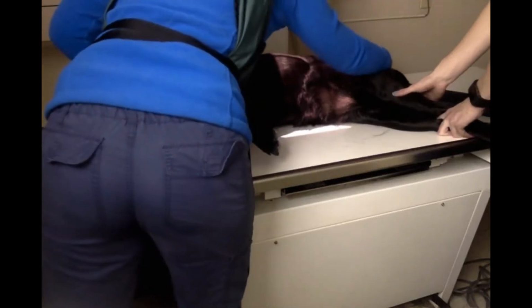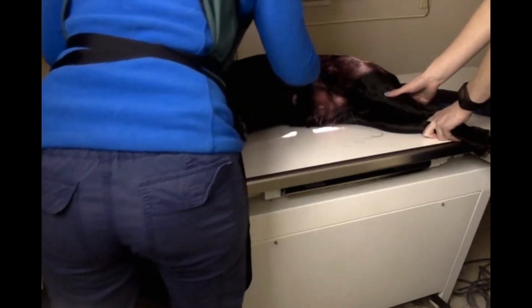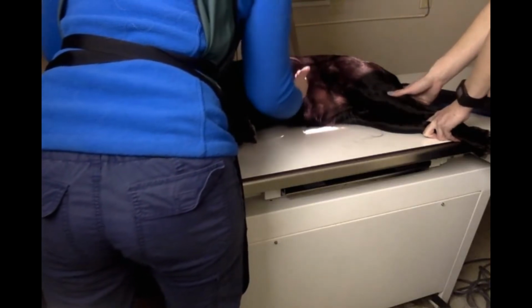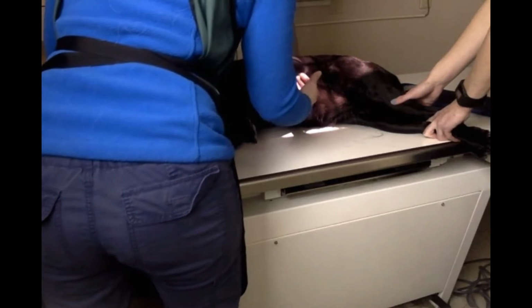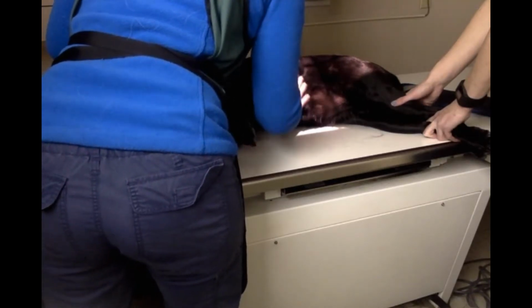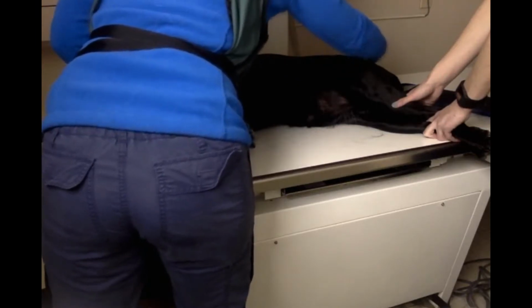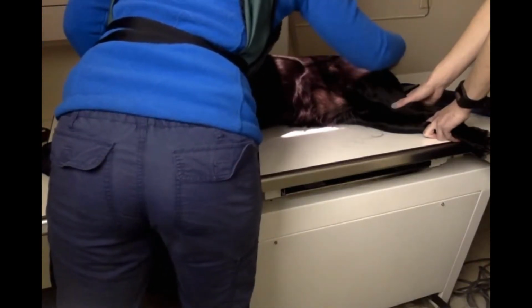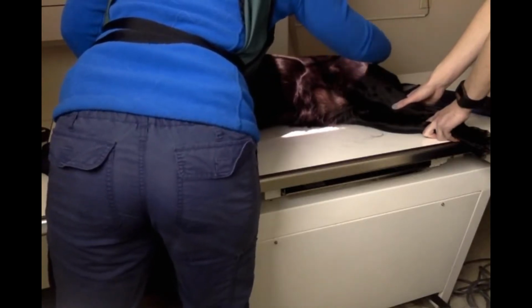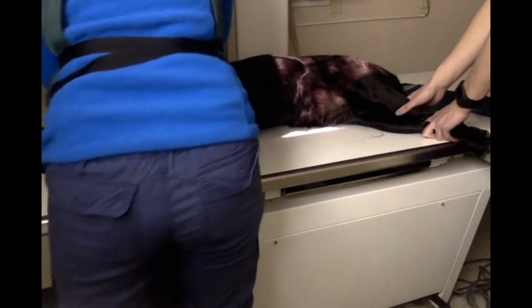All right, I can push her forward. There we go. So I'm feeling here. The ribs end right around here, so her diaphragm's going to be in this general area. I'm going to go just an inch or so up from the diaphragm and make sure I get the entire abdominal cavity. And then I'm going out past, I can feel her ischium right down here, so that should get most of the entire pelvis and the entire abdominal cavity here.